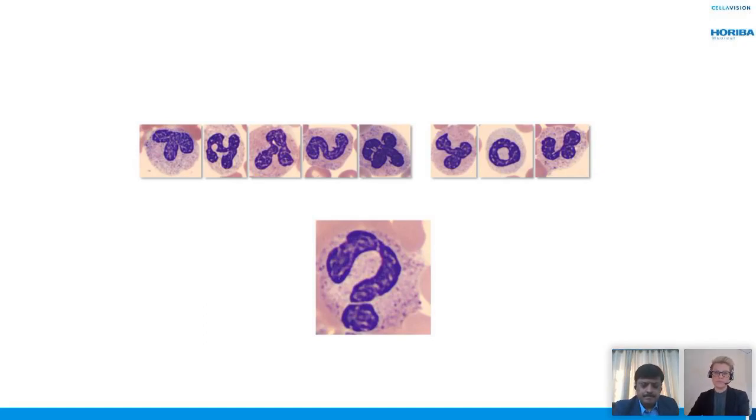If it's not run in the first 4 hours, what difference can it make on the smear? It can make a difference in how, for example, the RBCs and also the white cells are distributed. But what we've seen mostly is that when old samples are smeared, the RBCs change their shape. That makes it more difficult for the system to find a good monolayer area, and also more difficult to actually create a good monolayer area when making the smear.